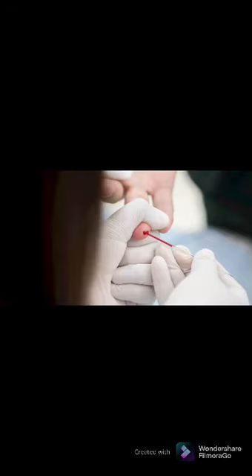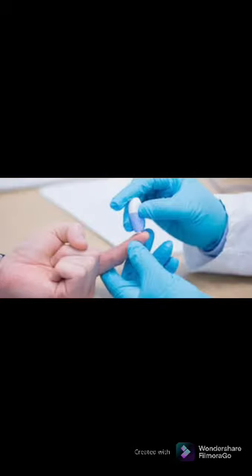Procedure for fingerstick capillary puncture. Review the test requests, approach, identify, and prepare the patient, verify diet restrictions and latex sensitivity. Sanitize your hands and put on gloves. Position the patient's arm, select the puncture site, and warm the fingers. Clean and air dry the site and prepare equipment.